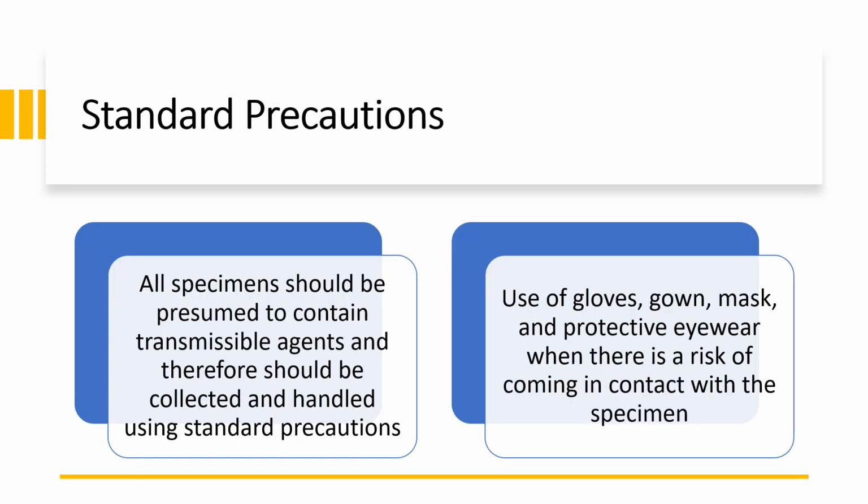All specimens should be presumed to contain transmissible agents and therefore should be collected and handled using standard precautions. Use gown, gloves, masks, and protective eyewear whenever there is a risk of coming in contact with the specimens.